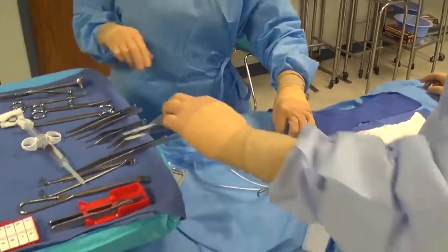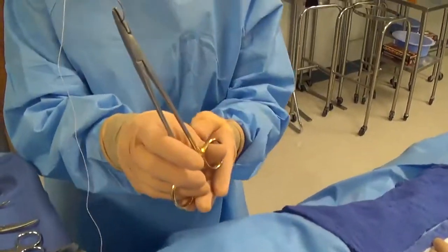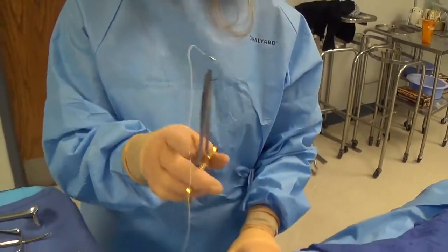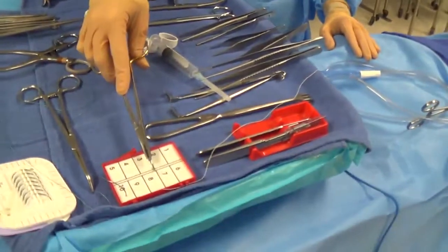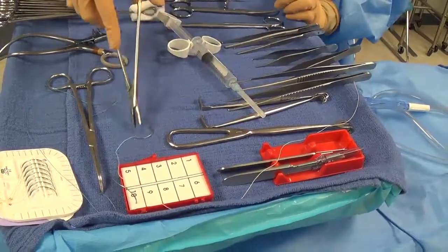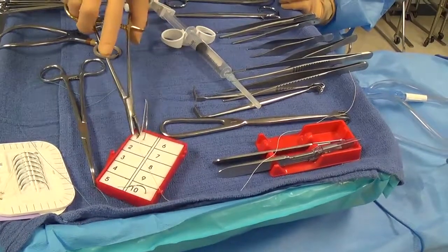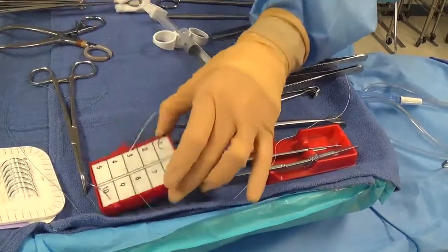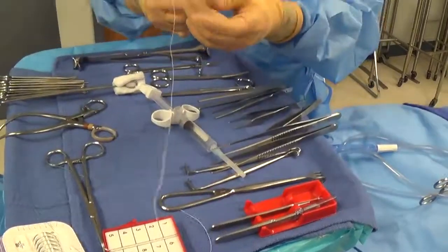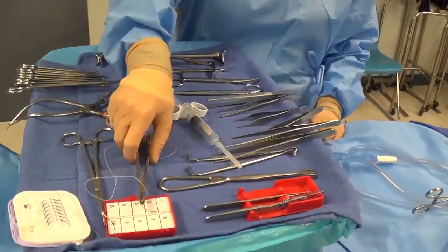When the surgeon is done, they may hand back the needle holder with the tip covered, or lay it down so it doesn't poke a hole in the drapes. Either way, it's never acceptable to touch a dirty needle with your fingers. Drop it, then pick it back up with your needle holder and position it into the needle book. Needle books have an adhesive back so they stay in place on the Mayo stand. If you don't have time, drop it in the magnet portion until you can reposition it — never touch a dirty needle with your fingers.